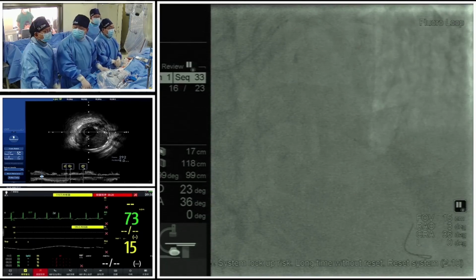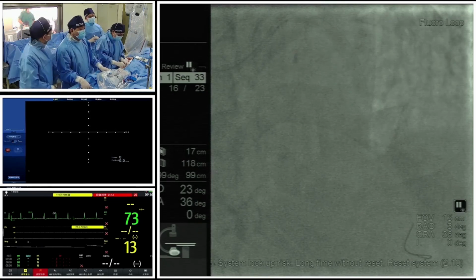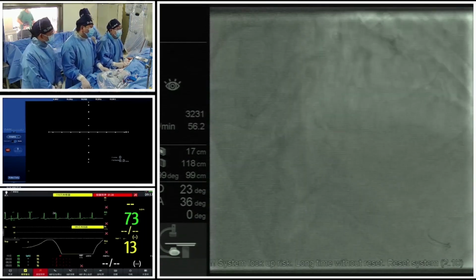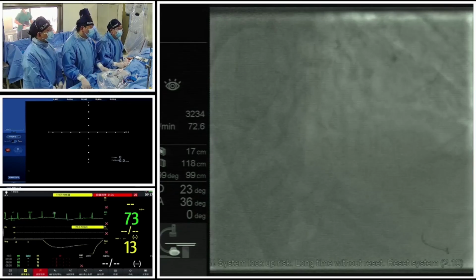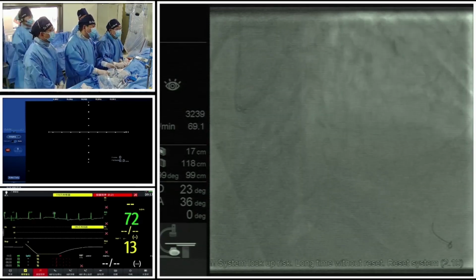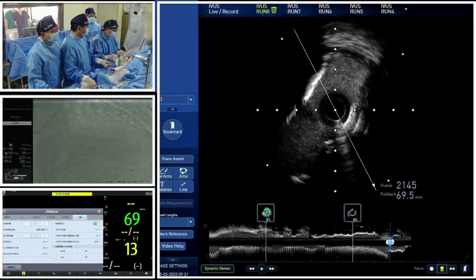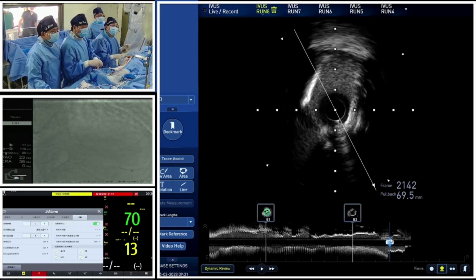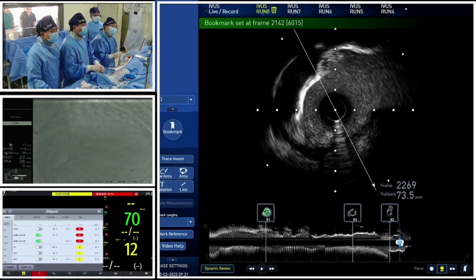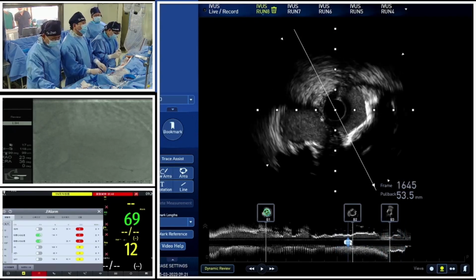And next, we will perform intravascular imaging. Yeah, you know what, Dr. Gong, I think after the pressure microcatheter FFR, we confirm the result of QFR, and this lesion in LAD should be treated. Actually, the pressure microcatheter FFR is a new technique invented by a Chinese company. Yeah, you're right. I think whether or not the fistula has impact on the functional assessment depends on the location of the fistula and also where it drains to, right? So right now, I think Dr. Gong has run the IVUS in LAD, right?